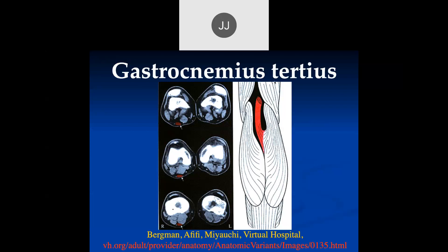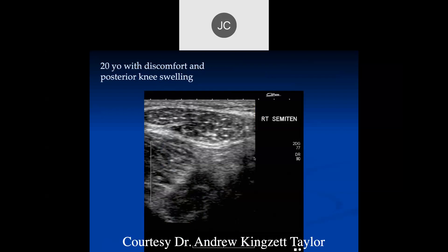There's another variant called the gastrocnemius tertius muscle — one of the more common muscle variants around the knee. Here we can see normal anatomy on the left side, and a gastrocnemius tertius tendon on the right side. There are actually two variants that can present in this same location. This is a 20-year-old with discomfort and posterior knee swelling, shown on ultrasound.